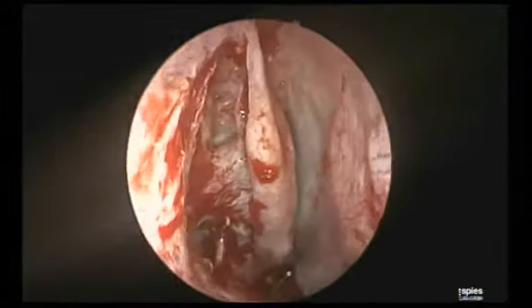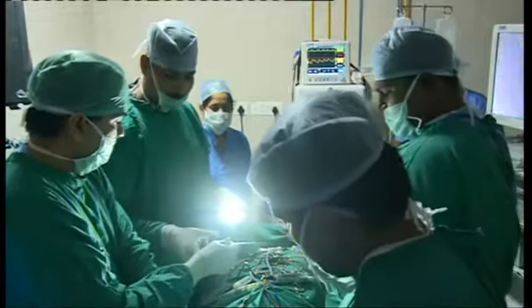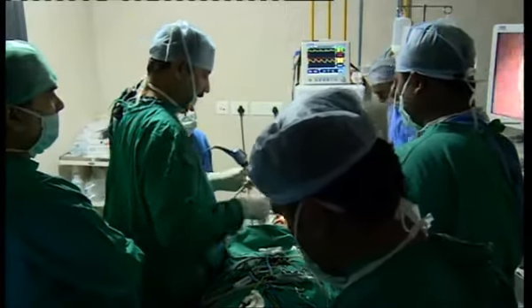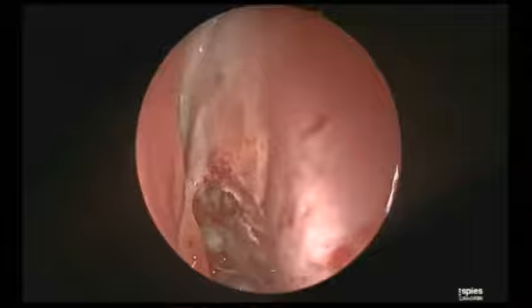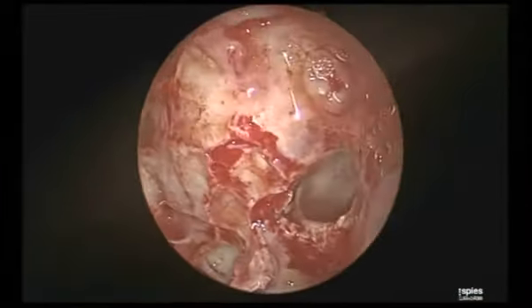See that? Super. This is with the 0 degree. Now with the 70. So now Janki is here, the bulla is intact. Yes, the bulla is intact. I hope they have induced the patient for Janki. Give me some water here. I'll go to the other side and show you the cavity. This is the other side cavity. The other side FESS, done with the 70 degree.